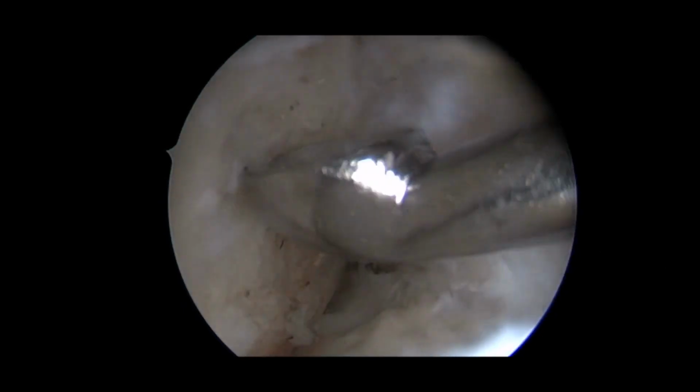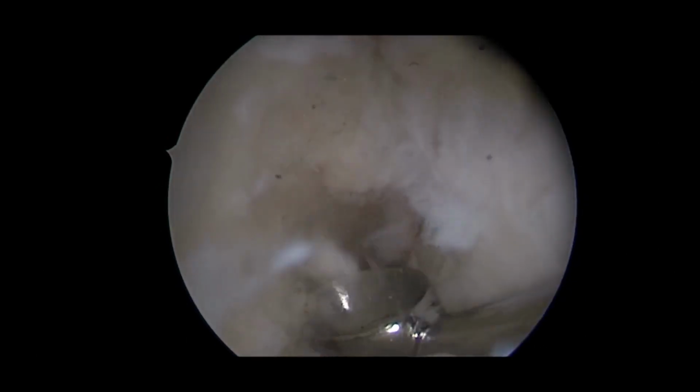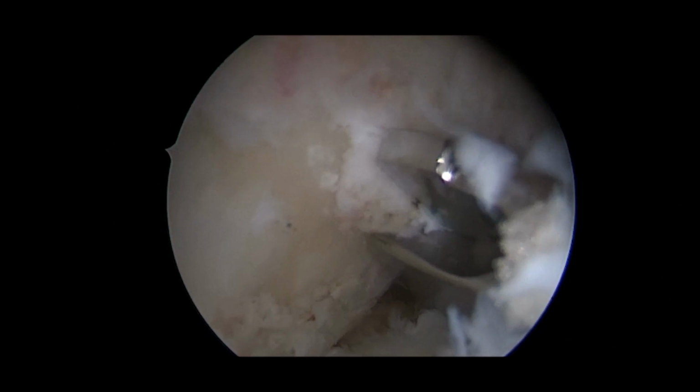The attachment point of ACL, in order to make it rough and promote good healing of our graft. This is the femoral jig of our ACL reconstruction system, trying to keep it horizontal, posterior, and around the 10 o'clock position.